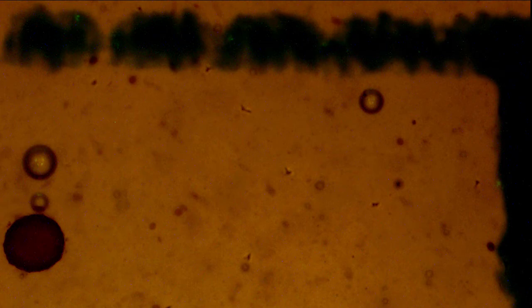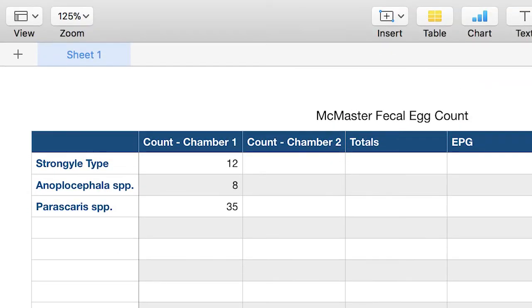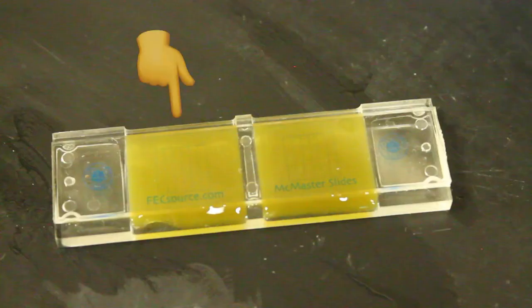Once you have finished one lane on the slide, you will proceed to the next lane and there are a total of six lanes per chamber. Once you have finished those, especially in the beginning, go ahead and write down the number of eggs that you found in that chamber. Next, you'll go over to the other side and count that grid as well.